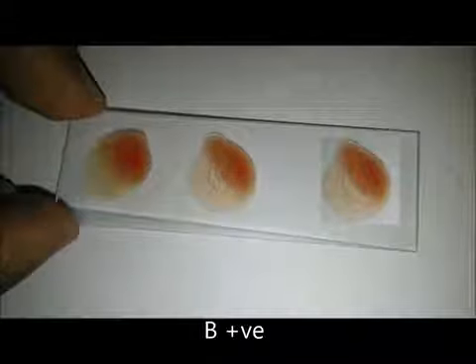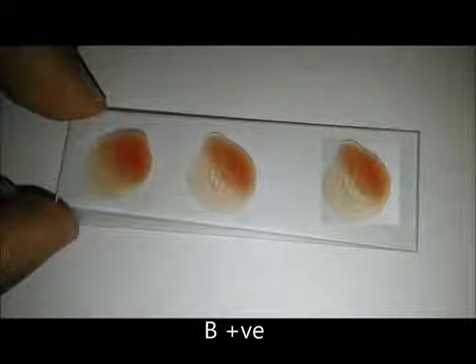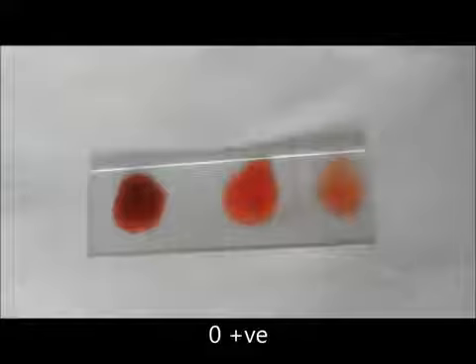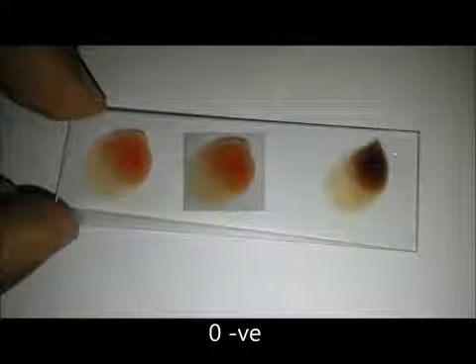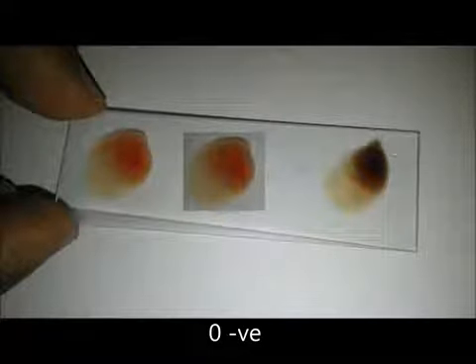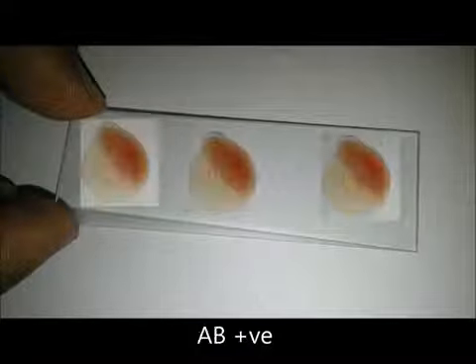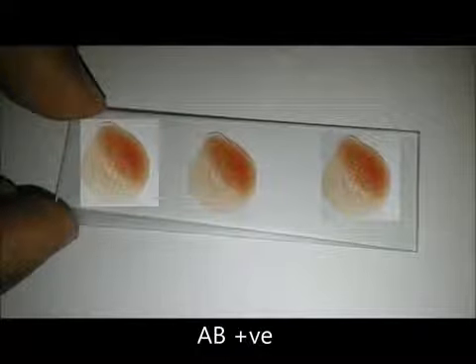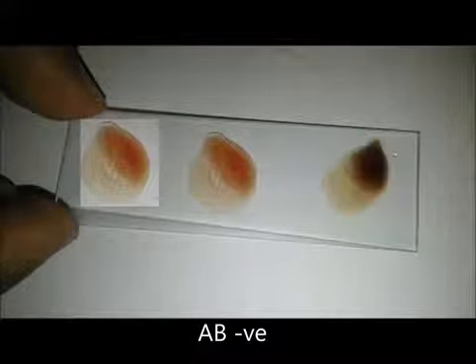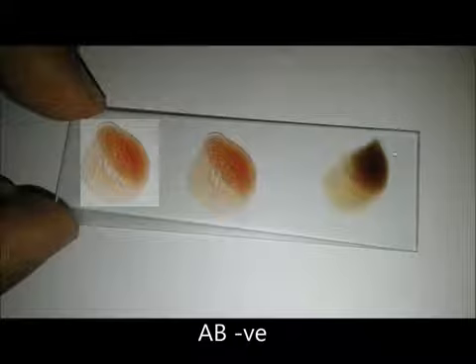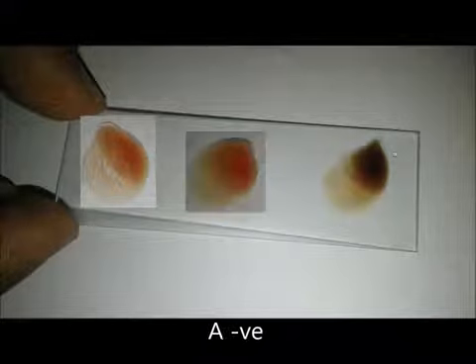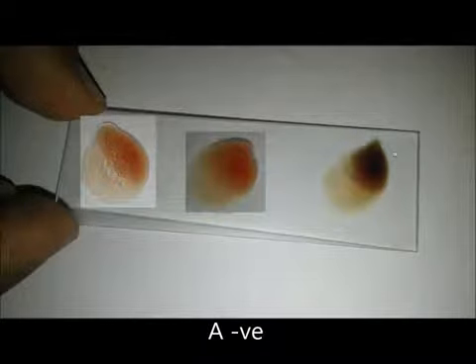Similarly, B positive looks like this, O positive is like this, O negative, AB positive, AB negative, A negative, and A positive.